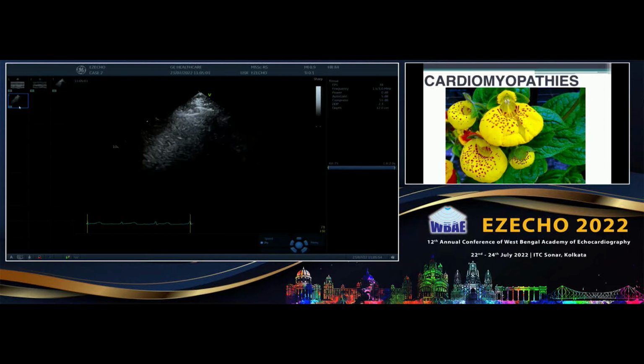Normally, you will always get a pleural sliding. Whenever you place the probe, the pleura should slide normally. Shimmering, sliding, there are a lot of names online. That is also helpful in telling whether the person is alive or not. I'm telling you, that's very important, because whenever we declare death, we check whether the heart is moving, because many times the heart just has blood in it.